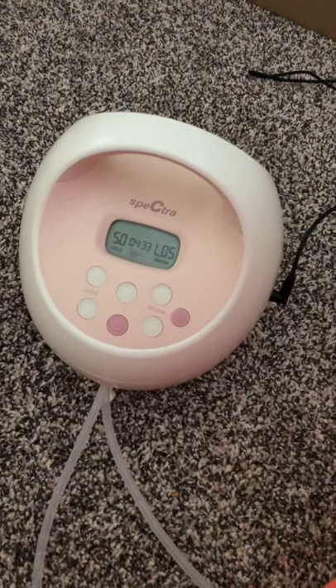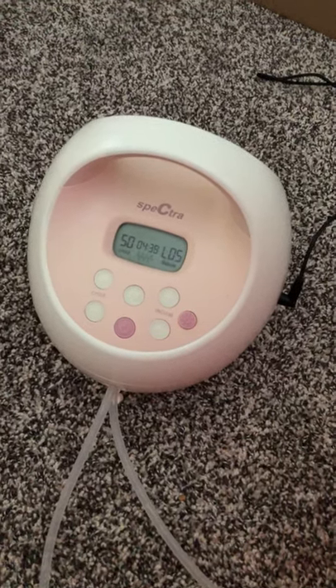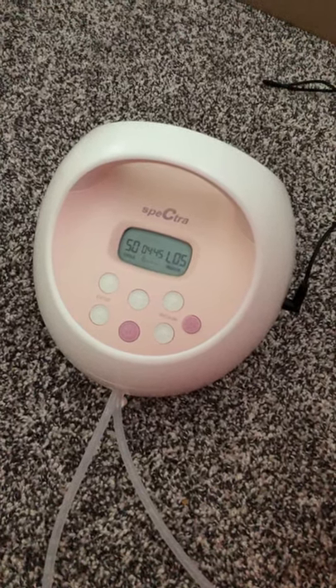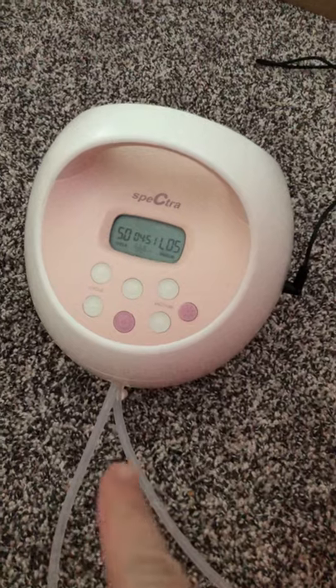Okay guys, so I am coming to you today just to show you the breast pump that I use and love. Some of you have been asking what kind of pump I have, so I thought I would show you and just give you a little quick and dirty rundown of how it works.